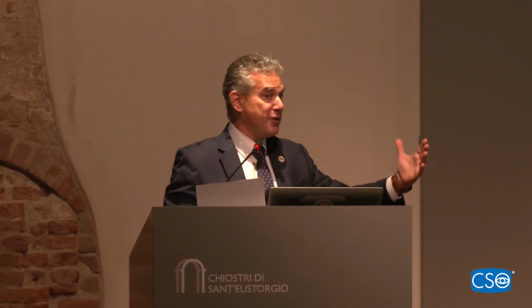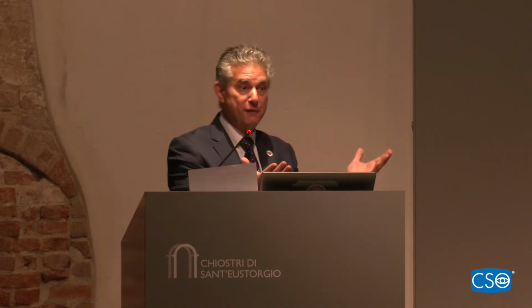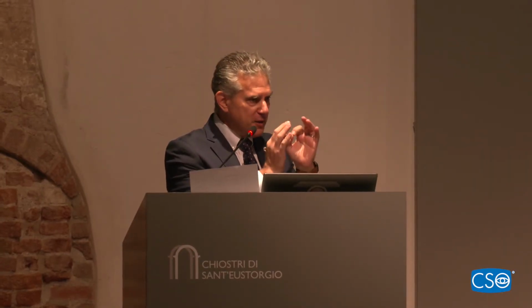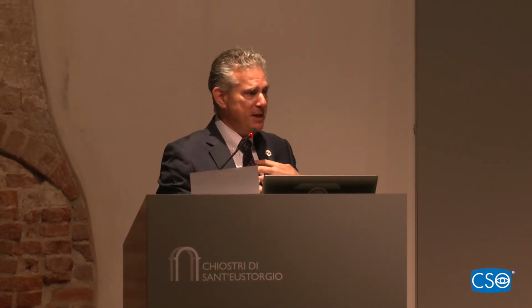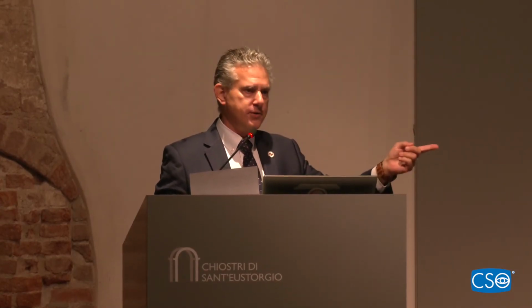of course, all the other OCT companies are starting to try to do topography and do the same thing now, obviously. But there's one advantage about this machine for me, which is that this company has been in topography for 30 years. And so their knowledge base and their analytical capabilities in the software are so far developed that if you're a company starting to write topography software, you're starting from scratch. And so this machine for me is really the most powerful device that I have in my clinic.